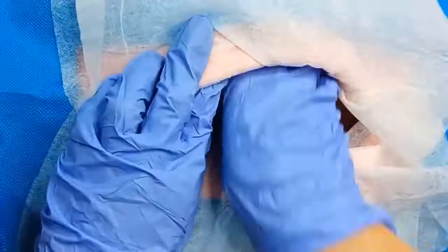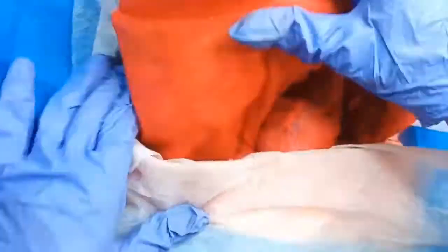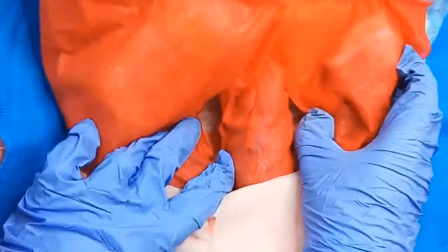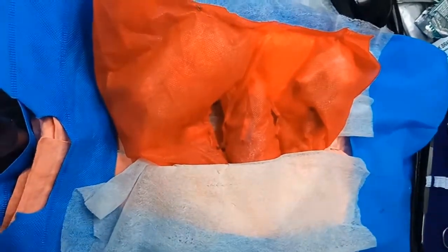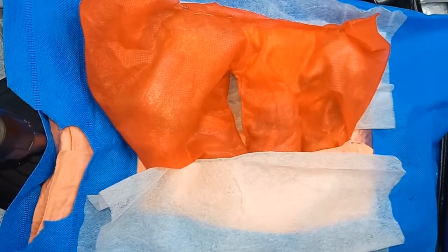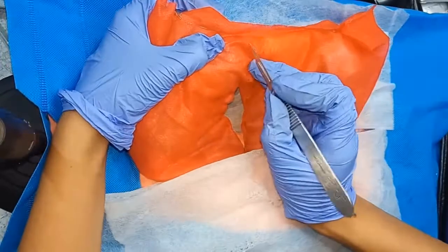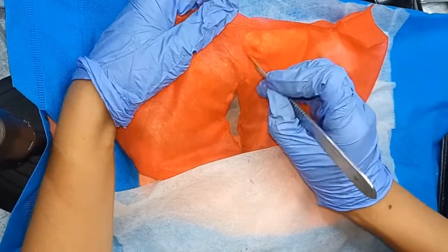The first uterine horn and then the second are exteriorized by carefully lifting through the incision. The surgeon should remember that the uterus is enlarged and should not be lacerated when the abdominal cavity is entered. So here, a small incision with a scalpel is then made in a relatively avascular area on the dorsal or ventral aspect of the uterine body.